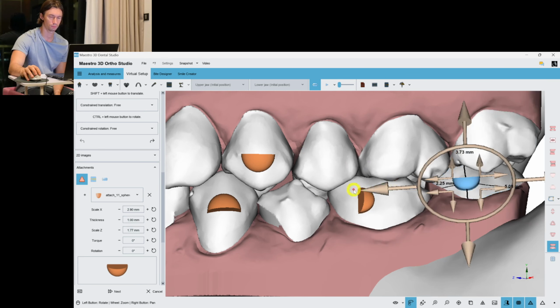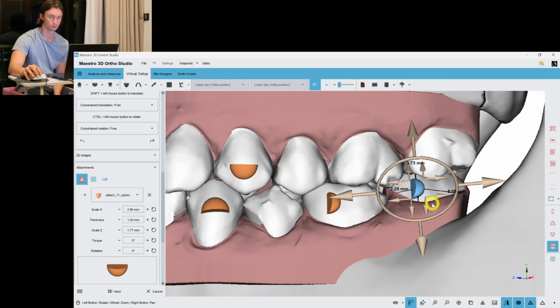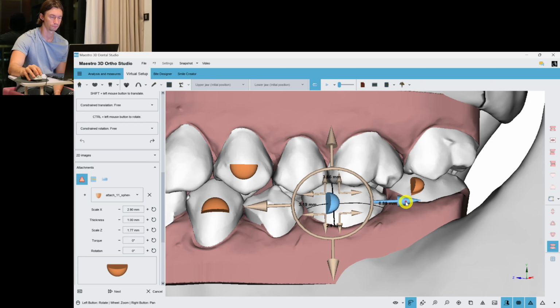And I also believe that the doctor will use pliers to increase the retention in this area, because I know he has the pliers from me.